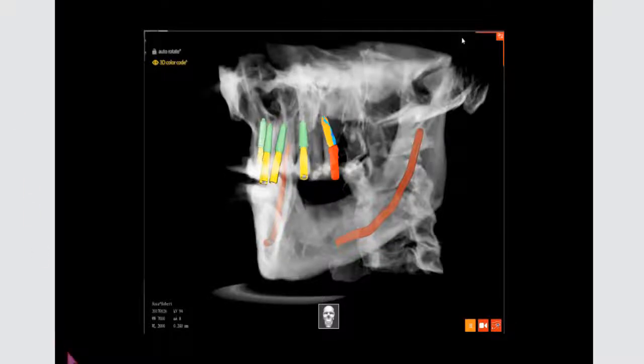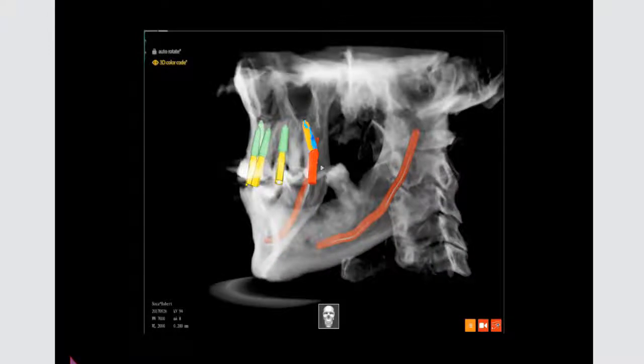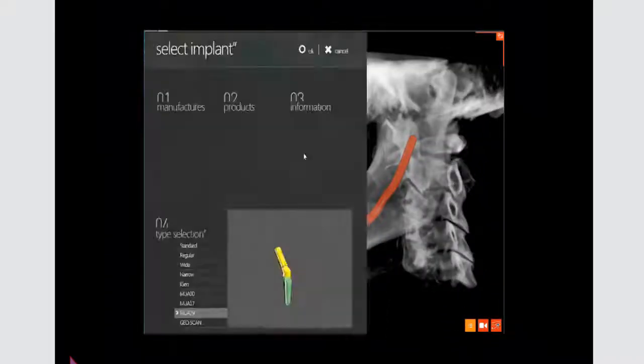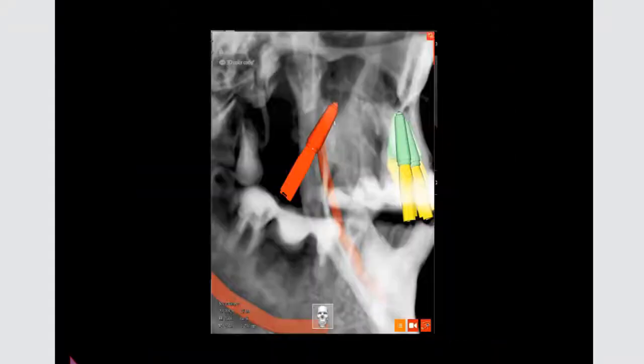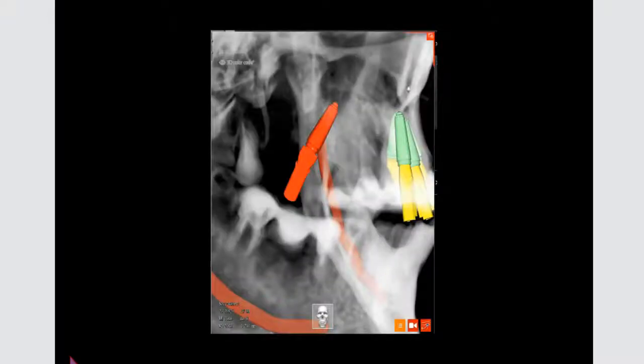When you get to a point where you're starting to look at positioning of implants, and especially when we're looking at, let's say, avoiding the maxillary sinus by placing a tilted implant in the posterior maxilla, we of course have to know that the abutments that we're going to utilize can be effective in re-angling that screw access hole so that we can, in fact, get the screw access hole within the envelope of the tooth that we're replacing.